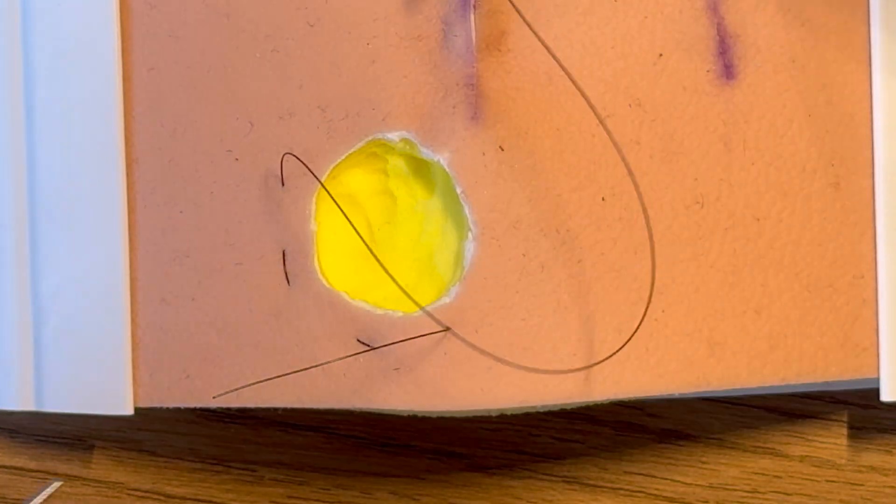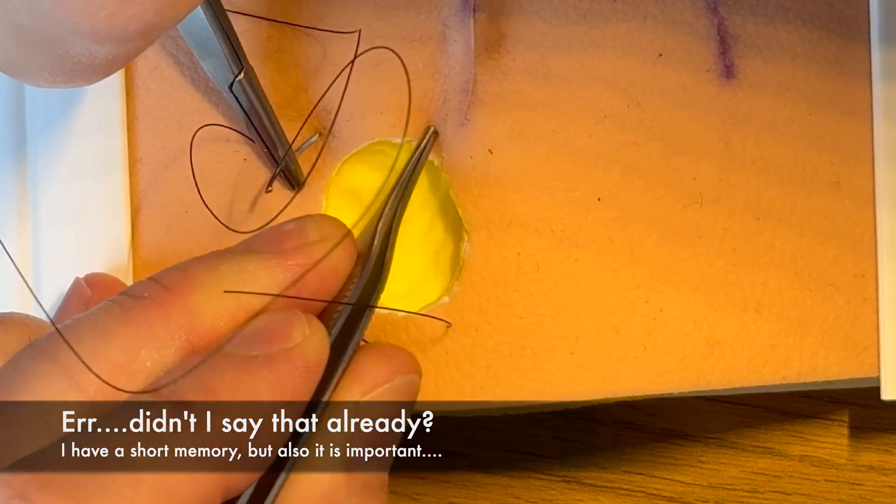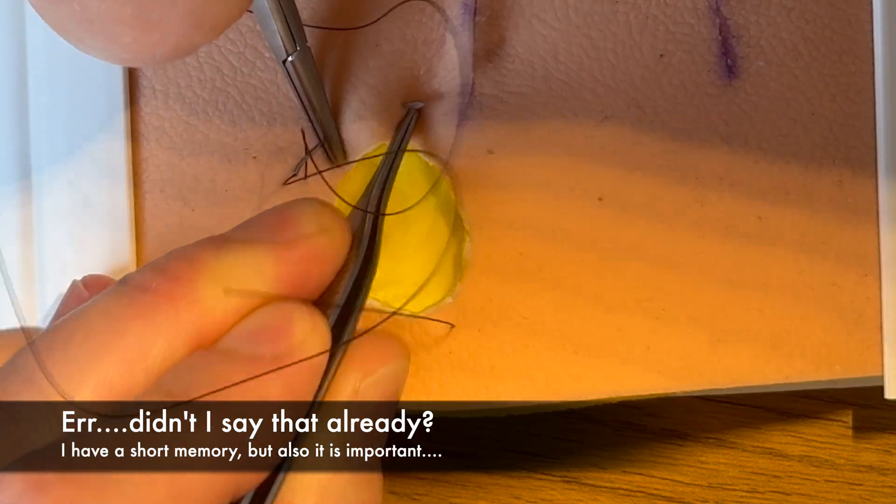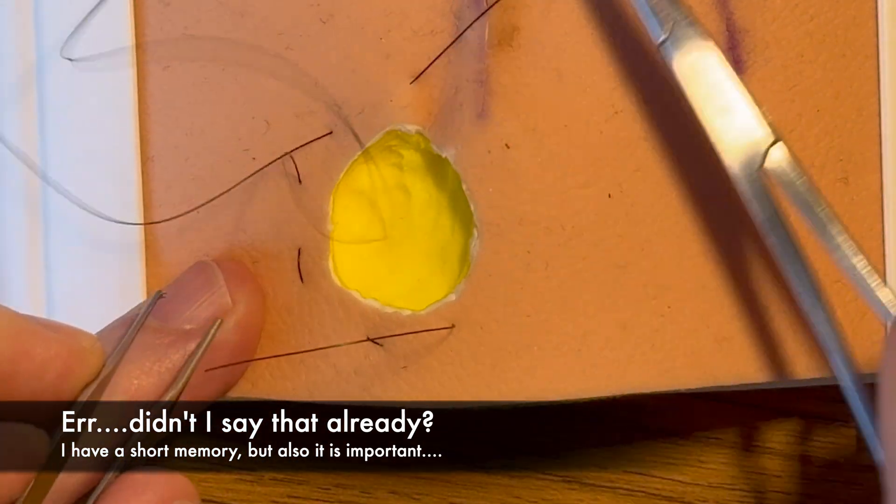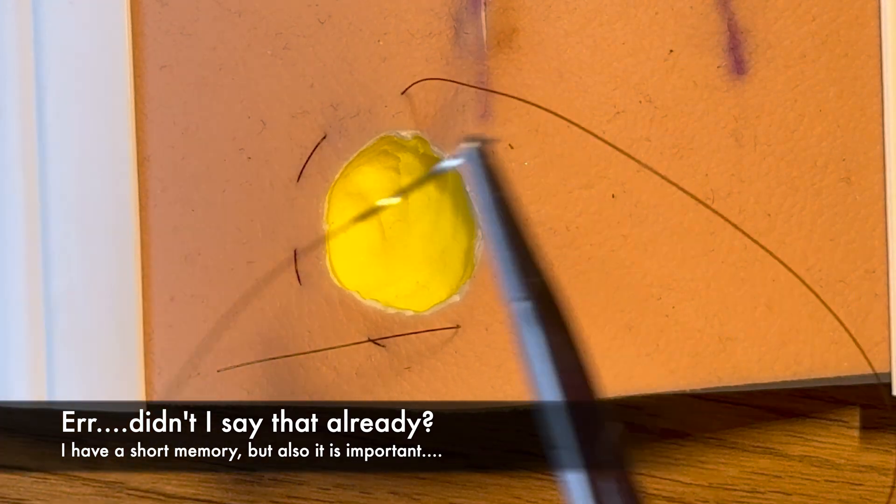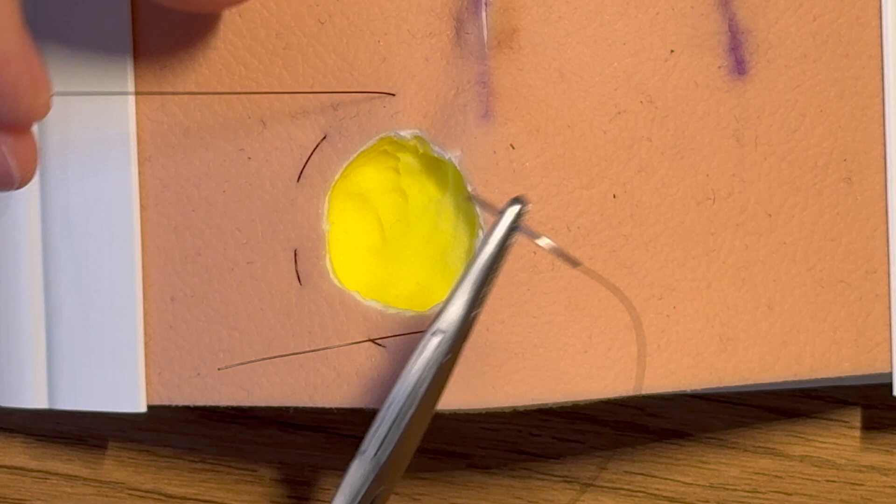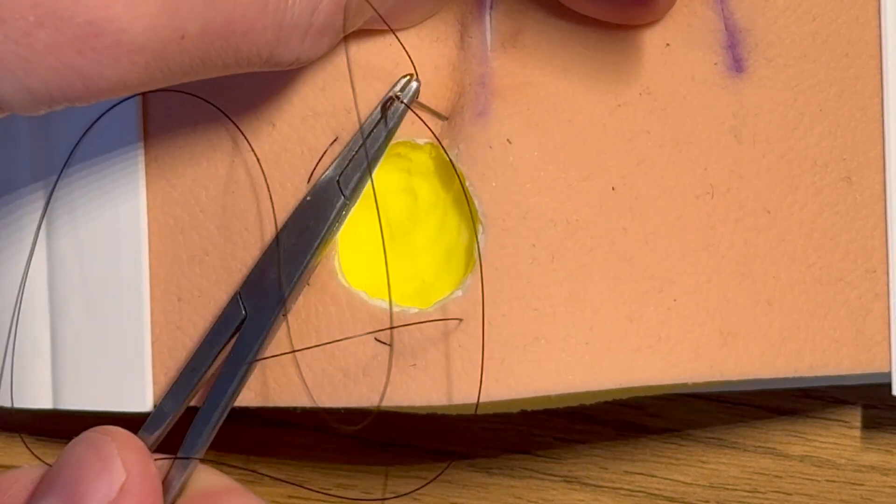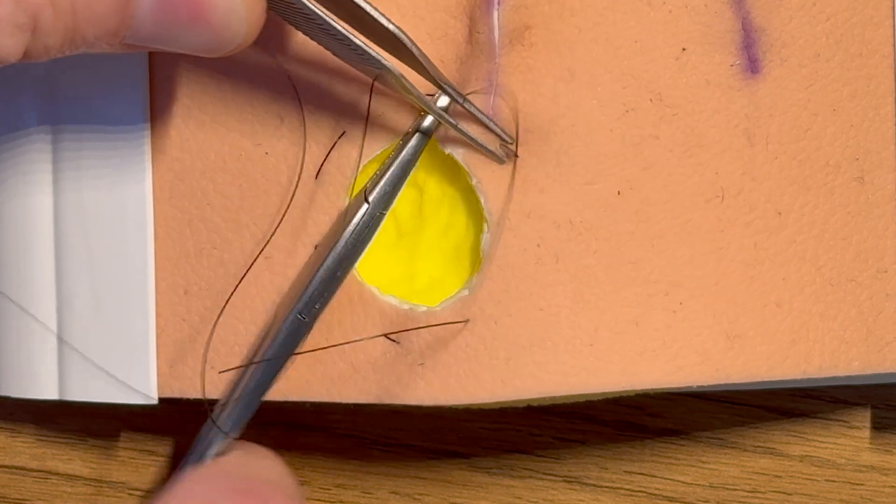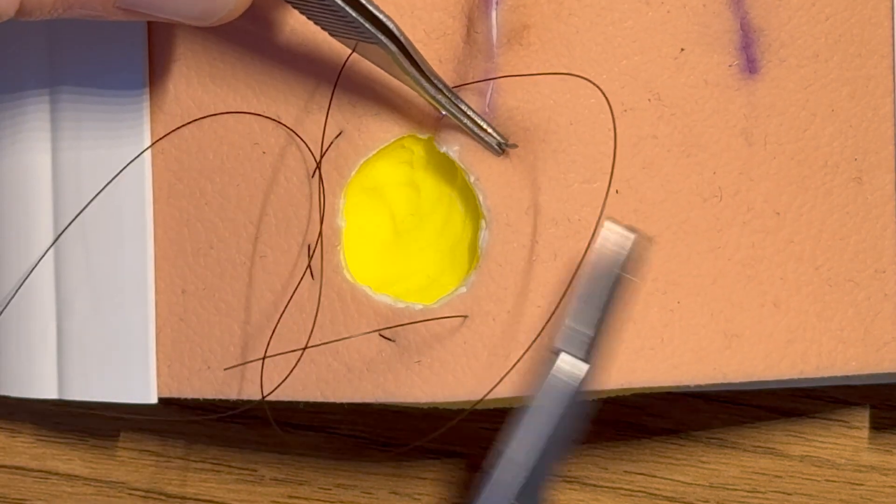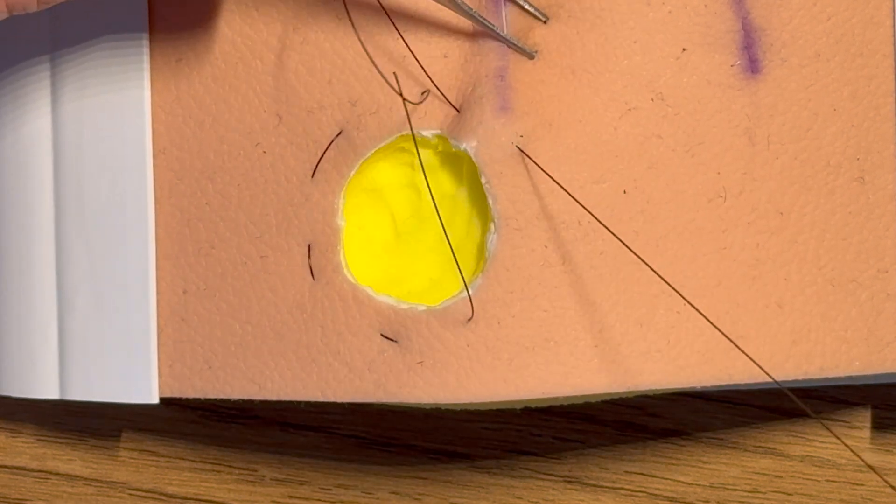And what we'd have to do is turn ourselves around or move around the patient on the bed and make it more ergonomic, or if you're ambidextrous suture with the other hand, or you can turn the needle around. So normally put it the other way around, you can turn it this way around, but the best thing to do is move yourself so that you're ergonomically positioned. And then to resist the temptation to press with the finger and press with an instrument instead. Don't grab the sharp tip, bring it through.